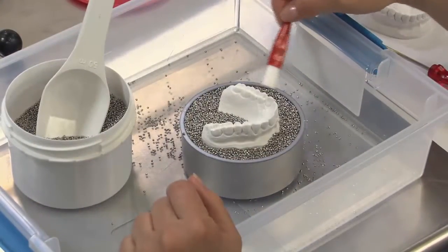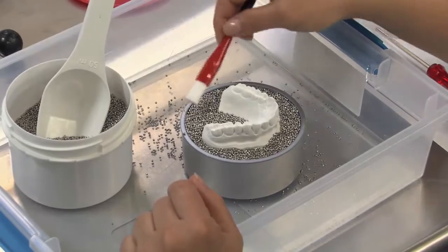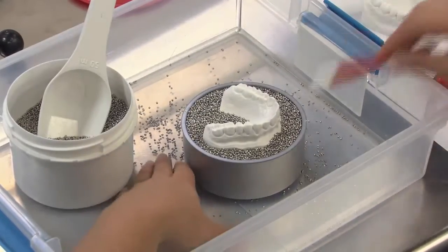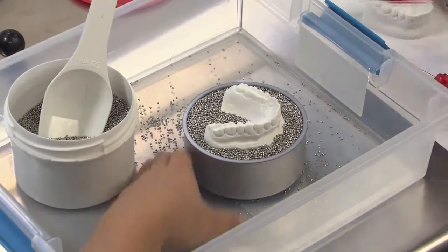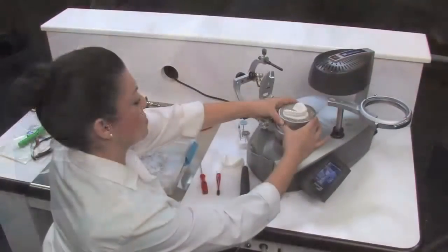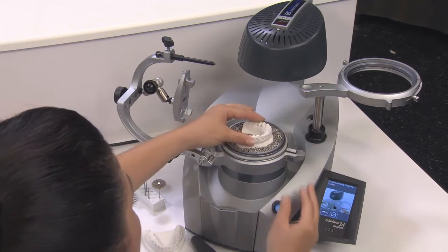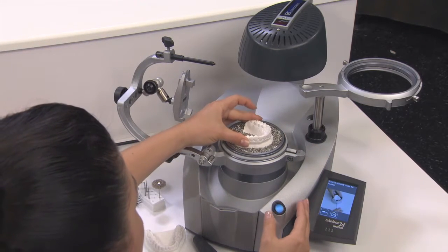Then, use the granule brush to gently spread or remove any unwanted granules. Inspect the model and pot to confirm proper positioning. Without disrupting the granules, pick up the pot and place it into the receptacle on the Aquiform machine.